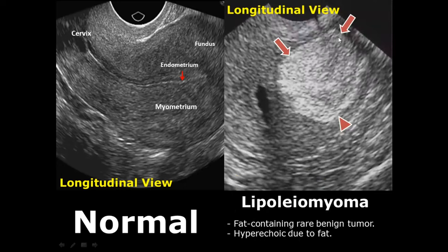Lipoleiomyoma is a benign fat-containing tumor of the uterus. It appears hyperechoic due to its fat content.